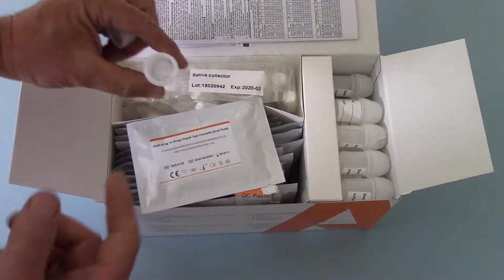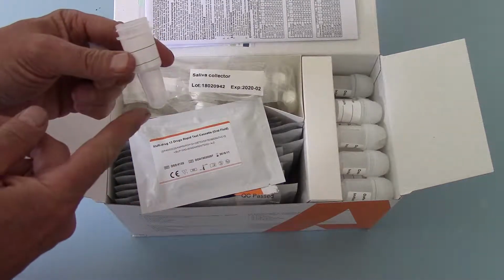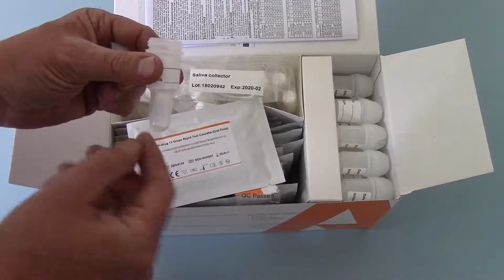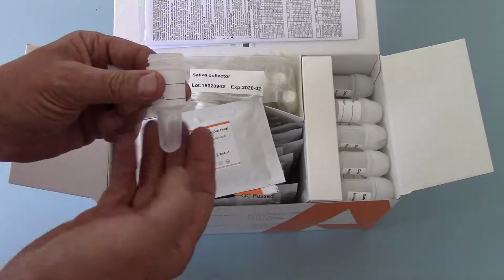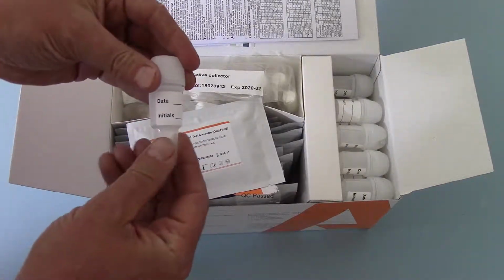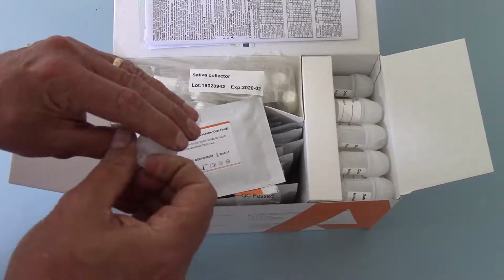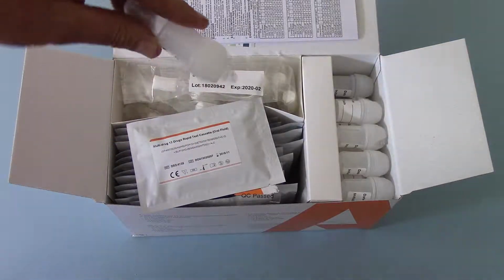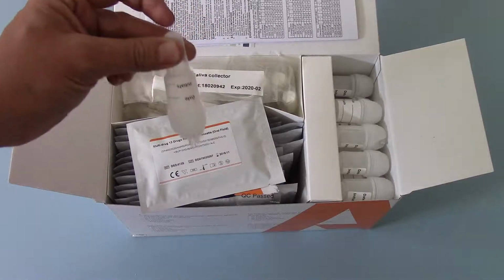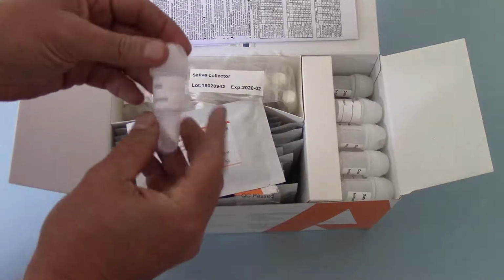These are nice and easy to use. You open the lid, the sponge when it's saturated goes in and discharges into this bottom vessel, so you can see very clearly how much saliva you're gaining. The bulb usually has an indicator level. It's very difficult to see, it won't actually show on this video, but you have got some guides on there in terms of the number of mils that you've collected. And then once you've collected adequate saliva, this lid screws back on, flip up the dispenser, invert the chamber, and you've basically got a squeezable bulb that dispatches 3 drops of saliva into each of the test sample windows. We'll show you that later in.